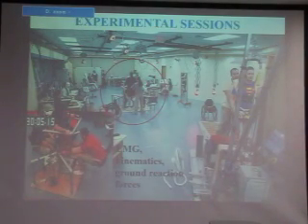So this is an image of our lab. There is a treadmill with body weight support, but mainly the standing experiments were performed over ground here, and we record the EMG activity, the kinematics through our Vicon system, and also the ground reaction forces through our pressure map.